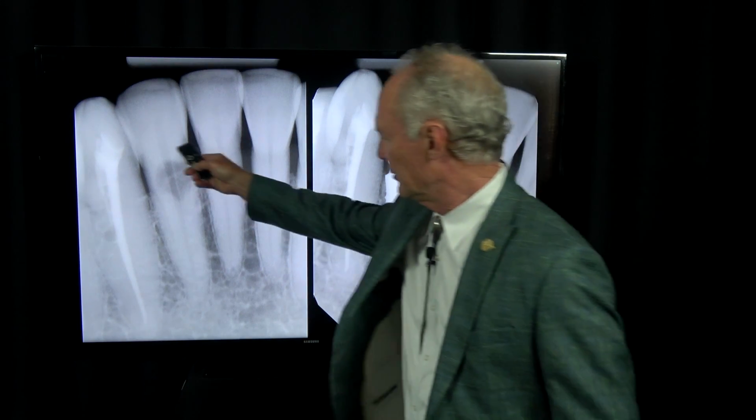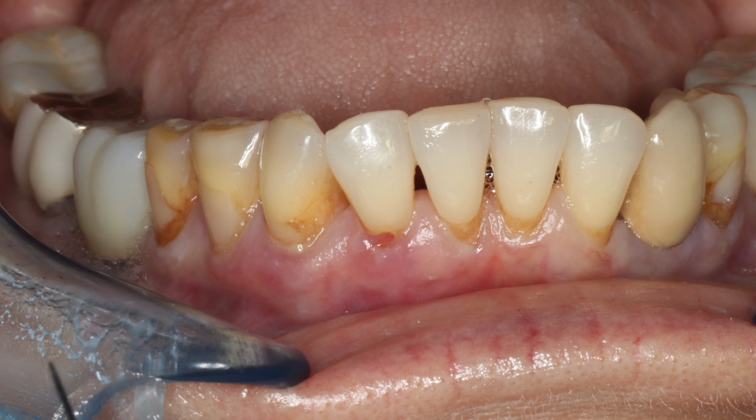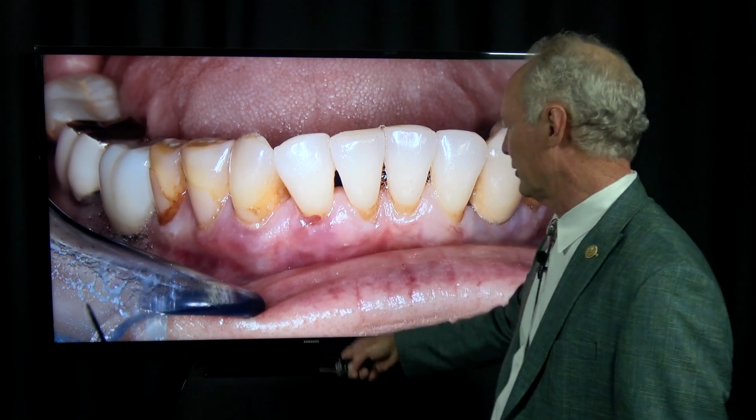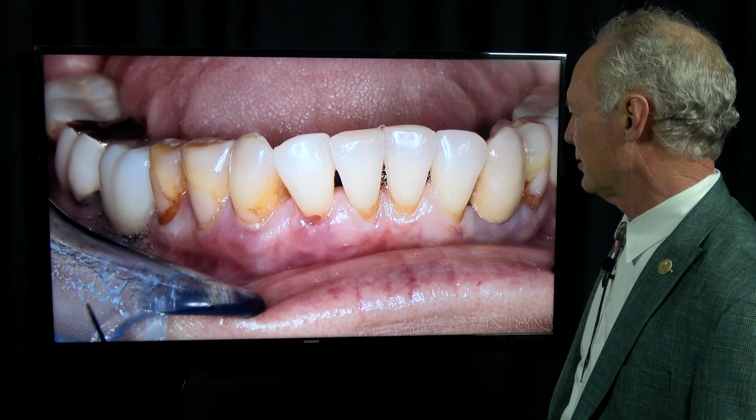So you can see the internal resorption. Here's the small diameter implant. This is always a difficult extraction because you know the tooth is probably going to fracture at the site of the internal resorption when you're extracting it.